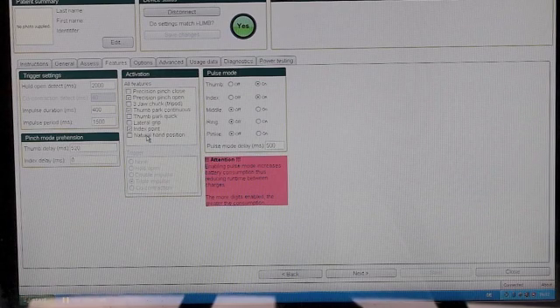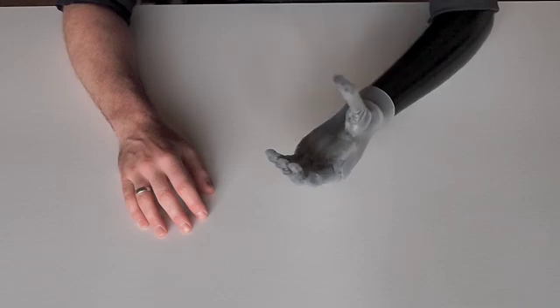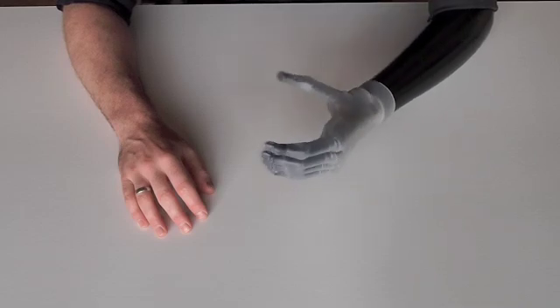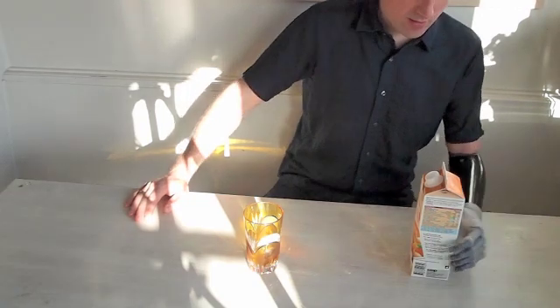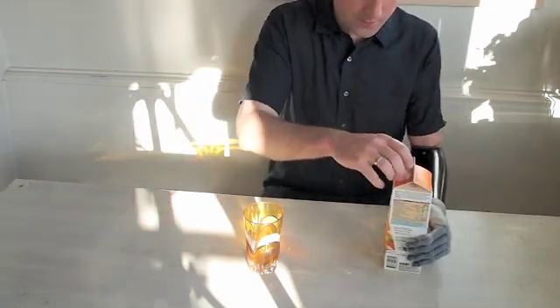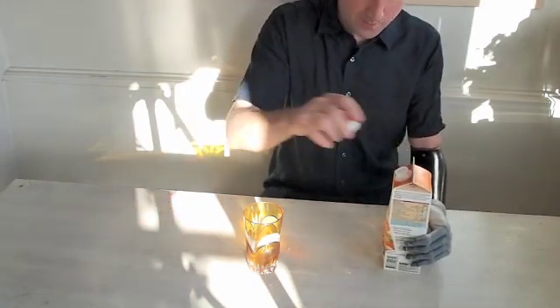This is my setup. You can see the list of available modes. I use a co-contraction for changing from the default grip mode to wrist rotation. That means I send a simultaneous muscle signal to both electrodes.